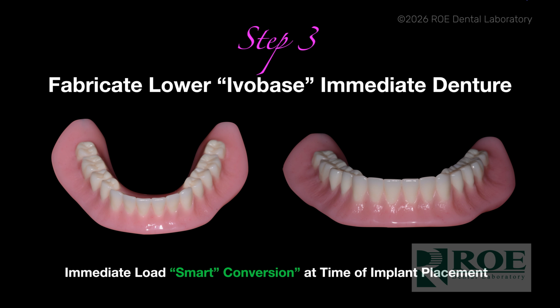And in this case, we're going to use what's called a smart conversion, which is a really unique and simple way to do these conversions without having to put these big holes in the denture that can weaken the denture and make it more prone to fracture during healing.